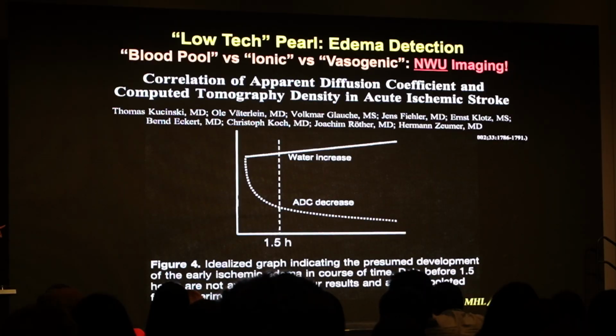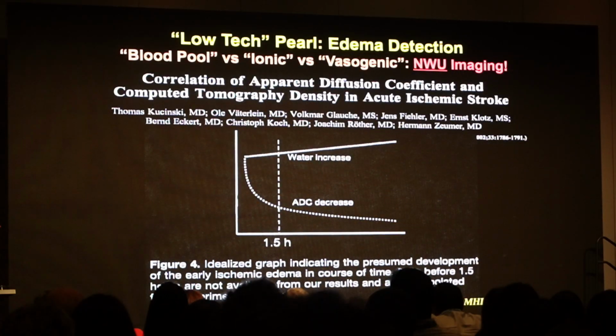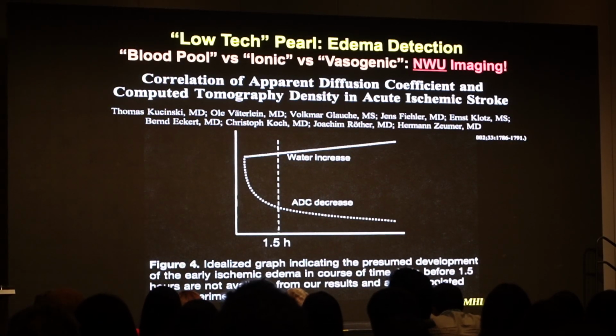And this paper was also written by all my friends. Some of these are co-authors of the paper I just told you about that we're working on, but it's all water. That's what you're seeing on NCT. You're seeing edema. Is it all water? I'm exaggerating a little bit.